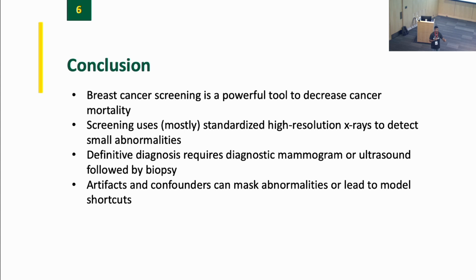It is a known phenomenon in medical imaging that if you train your model on one manufacturer, for example GE chest x-rays, it will perform worse on Siemens chest x-rays because it hasn't seen them before. As a human being, when I look at a chest x-ray, I can't tell what manufacturer it came from, no more than I can tell what race the patient was, but machines can pick up those subtle differences and patterns in the noise and the detector and whatever else it might be. So in general, you want to have data from multiple scanners and multiple sources when training and validating. I know there's one more question.